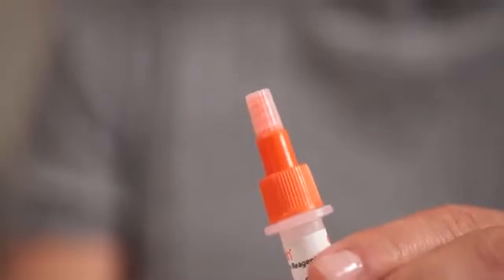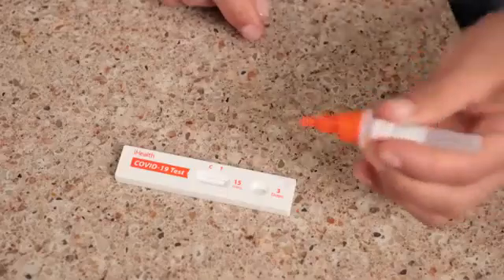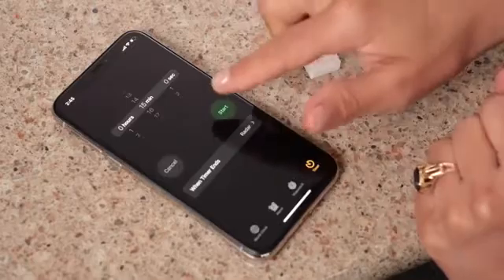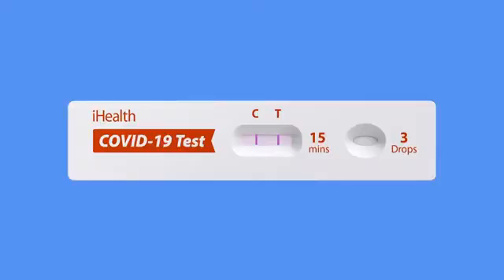Now, let's test the sample. Remove the small dropper lid at the tip of your test tube and carefully squeeze 3 drops of solution into the receiving port on the test card. Set a timer for 15 minutes. You'll see your sample being slowly absorbed into the test strip, and over the next 15 minutes, your results will appear on the test strip as lines under the C and potentially the T.